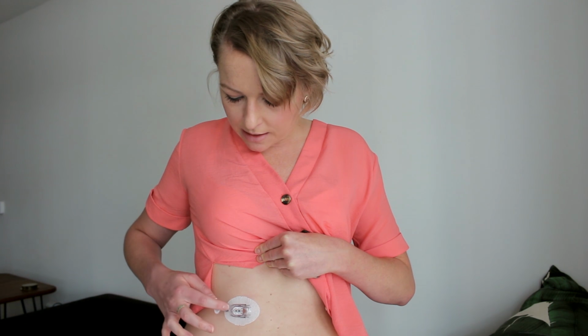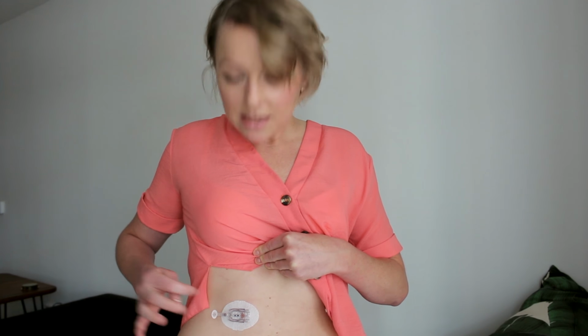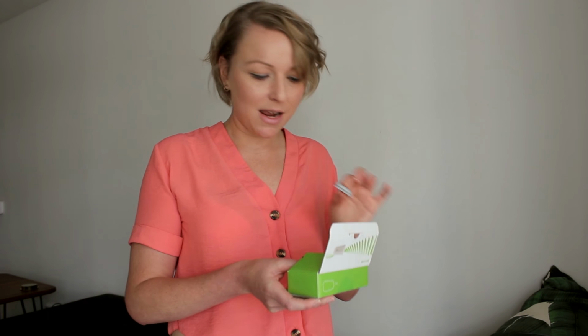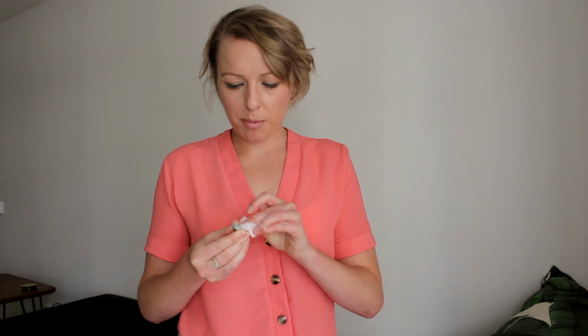to get the transmitter in, and this flappy bit, which I guess is the important bit. Going to grab the transmitter out of its shiny box. Looks very important and something I shouldn't break if at all possible. Give the back a rub with the alcohol wipe, good and proper there. Want it to be nice and clean. Let it dry.